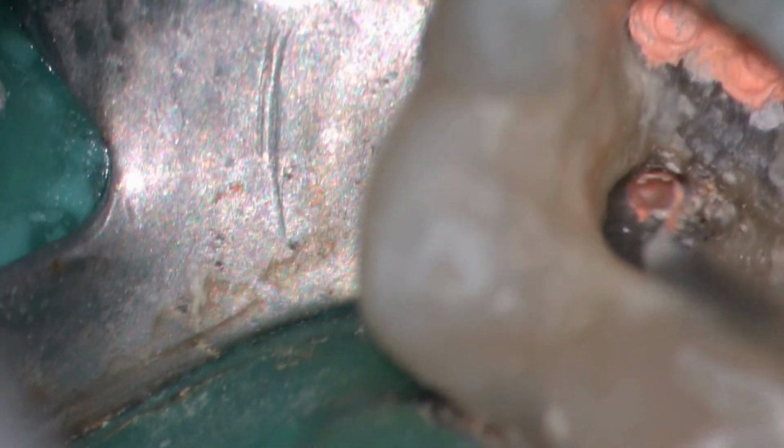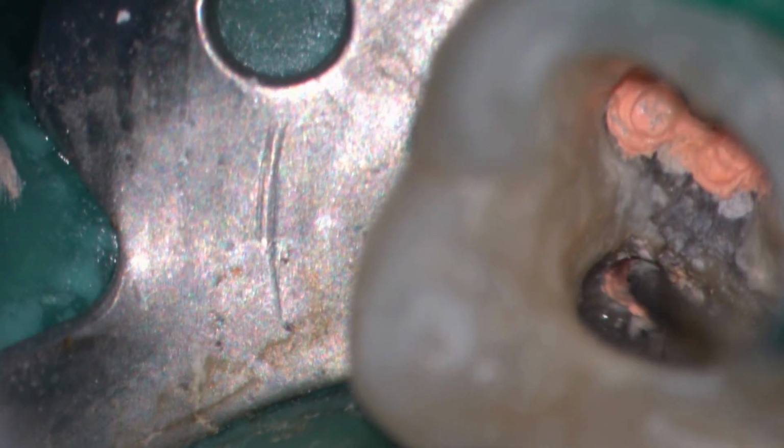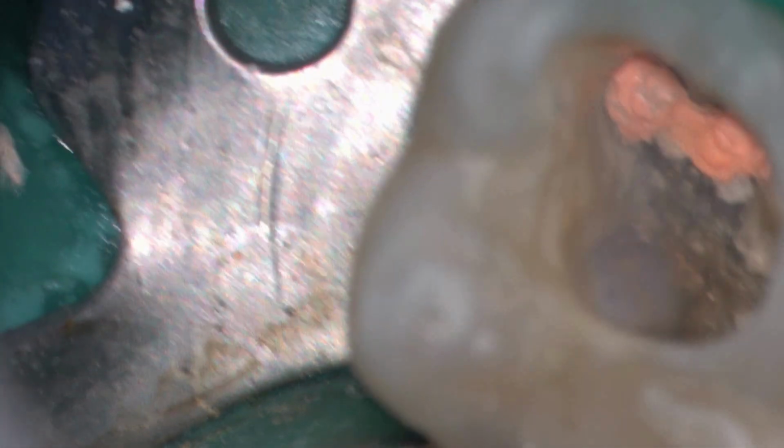One thing you'll note is a tentacle of resorption space coursing alongside the distal buccal canal that was a little bit perplexing to me. You'll note I was playing around with it, and as I compressed the gutta percha into the DB canal, I noticed it expressed out with some sealer, and I eventually just filled this space in with the gutta percha and sealer also, even though it looked like there may have been some external communication outside the root in this area.